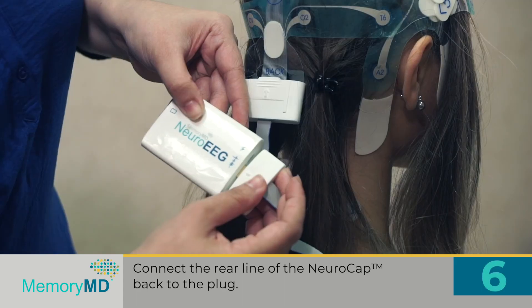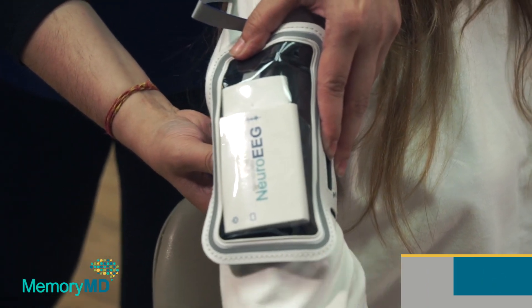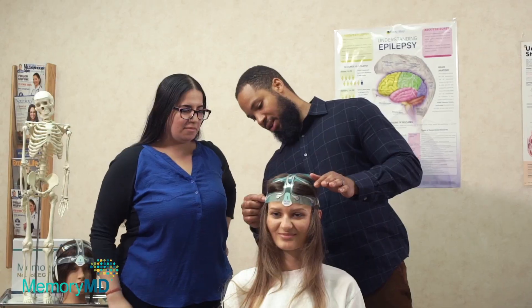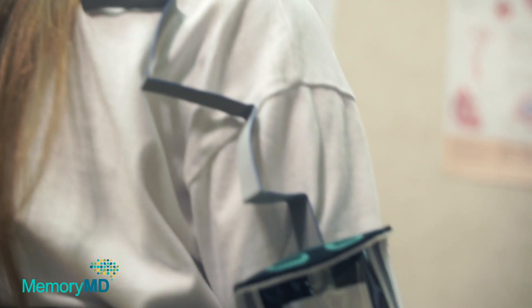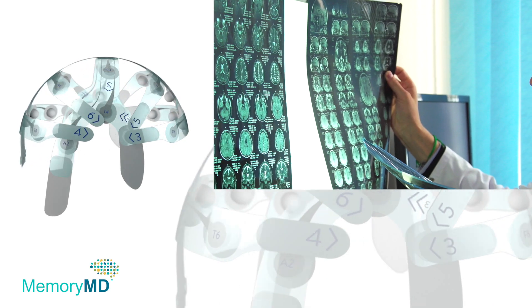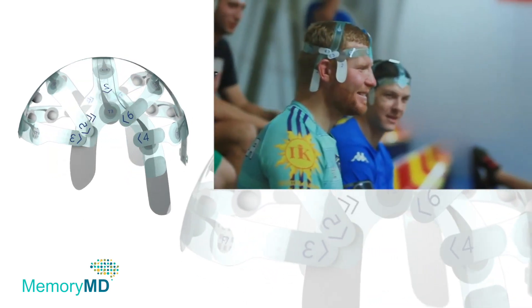NeuroCap works in line with the Neuro-EEG amplifier device to speed up the preparation for EEG studies to under 5 minutes. Medical staff of any level can perform an EEG test after only one hour of training and no prior experience. NeuroCap can be implemented in urban and rural emergency departments, intensive care units, operating rooms, urgent care facilities, neurology practices, and even the sports field.